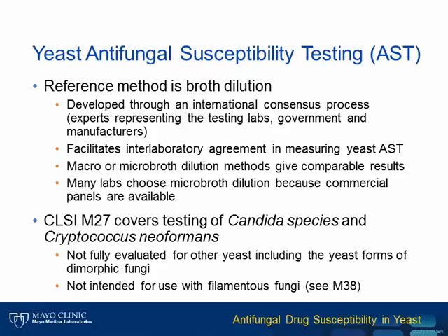The recognized reference method for antifungal susceptibility testing of yeast is broth dilution. The method was developed and agreed upon through an international consensus process that tapped the knowledge and experience of mycology experts in clinical microbiology laboratories, government entities such as the CDC, the FDA, and the Canadian Public Health Services, as well as those from the pharmaceutical industry and device manufacturers. The use of a reference method greatly facilitates interlaboratory agreement when testing yeast for resistance to antifungal agents and enhances patient care by providing robust susceptibility results regardless of the geographic location of the patient.